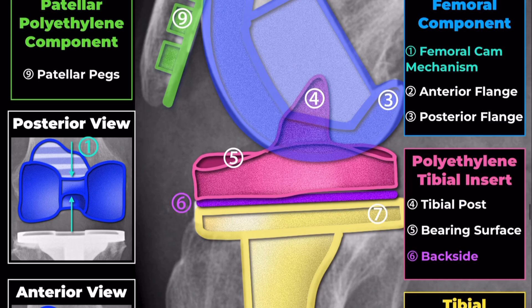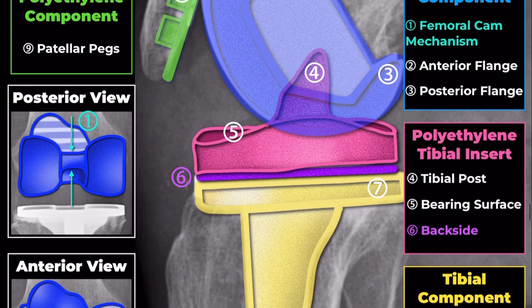Polyethylene Tibial Insert. Tibial Post: the tibial post is a vertical projection that interacts with the femoral cam mechanism to provide stability and facilitate proper movement of the knee joint. Bearing Surface: this articulating surface contacts the femoral component. It is designed to withstand the forces of daily activities and reduce wear.